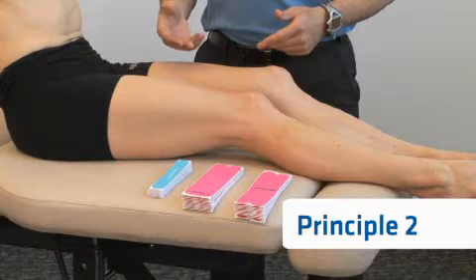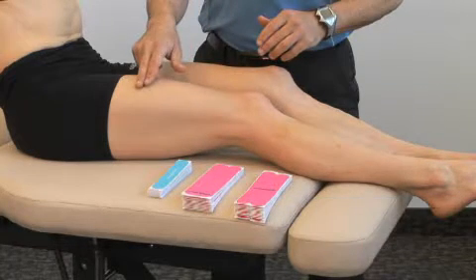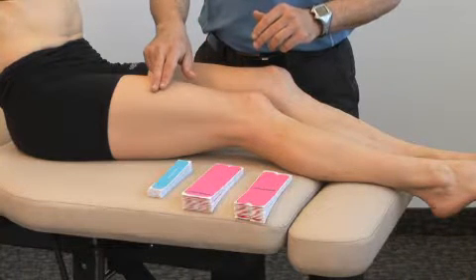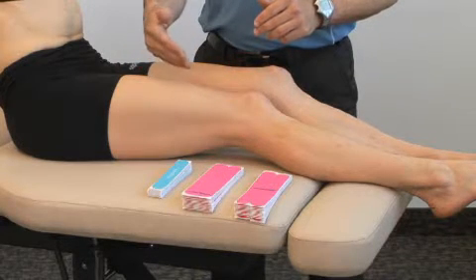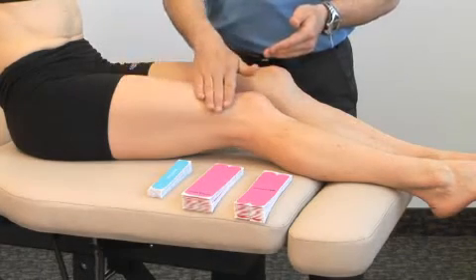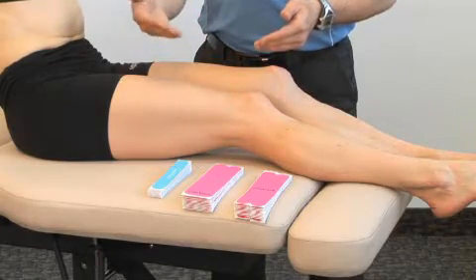For principle number two, the tape should only be applied to skin that is not irritated or broken. A test strip of tape can be applied to the skin and worn to see if there are any reactions. If a reaction does occur where the patient experiences any increase in discomfort, the tape should be removed and a damp cloth wiped over top of the skin, and then let your healthcare professional know about the reaction.